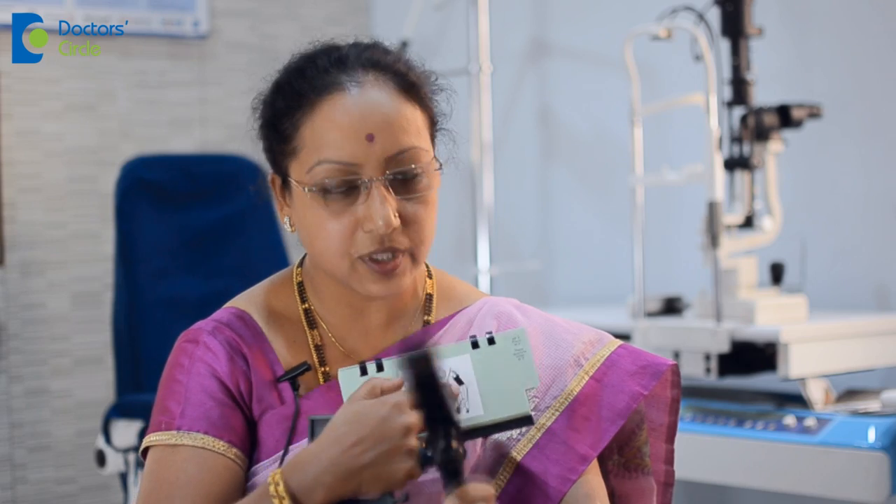I will just show you a couple of things we may want to use to improve your convergence or accommodation. This is something we can use where basically the person will look through the small aperture and sees two objects here. Unless the person can fuse, can bring their eyes closer, these objects may not be visible together. The two of them will not look as one.